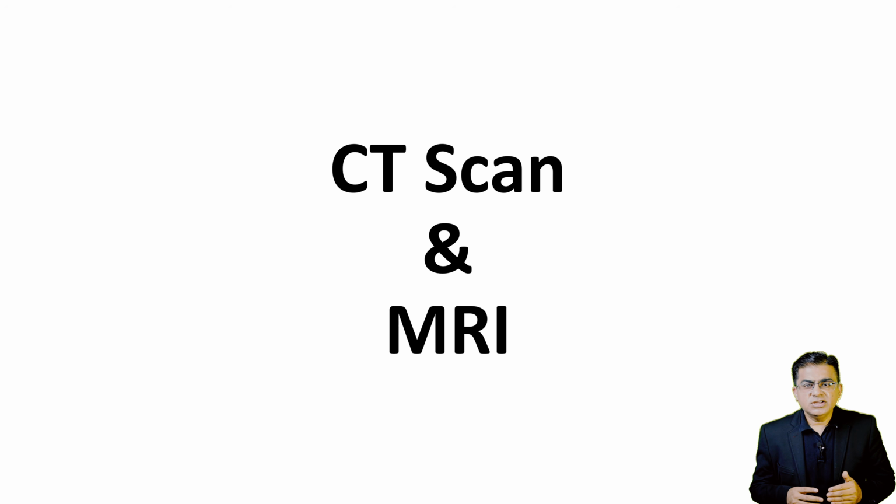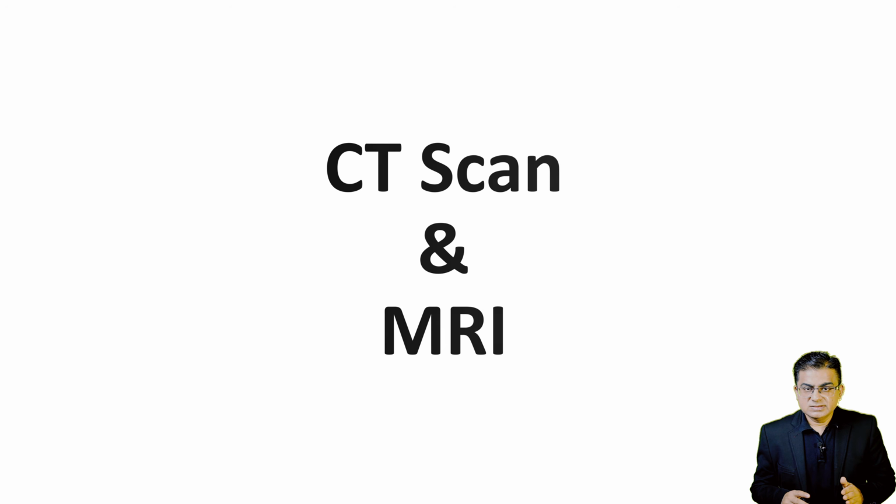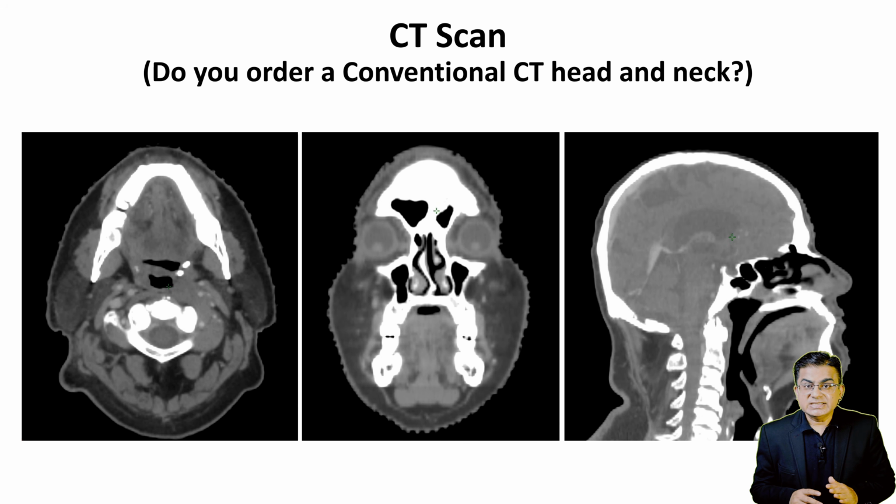I think many of you who are not beginners might be knowing it, but those who are beginners might not be knowing it well. Many of you have been doing a conventional CT scan for many years, which is not the right scan. I will show you what an ideal CT actually should be and look like.